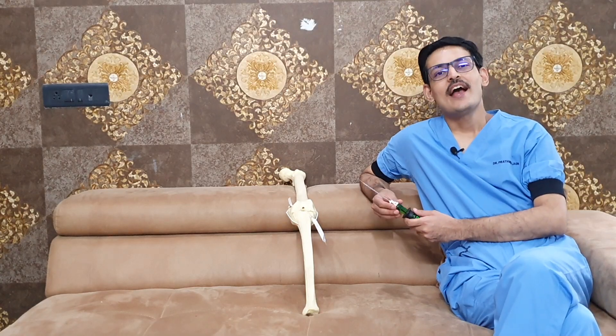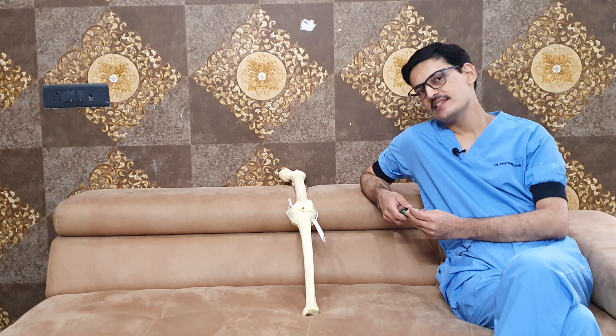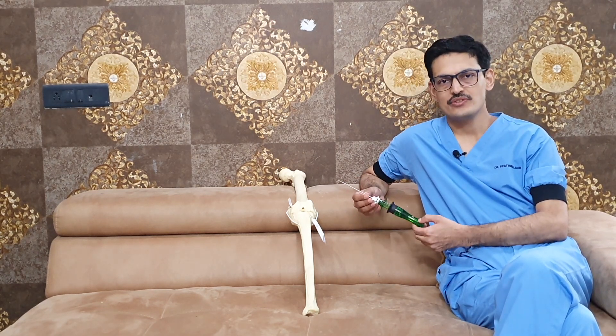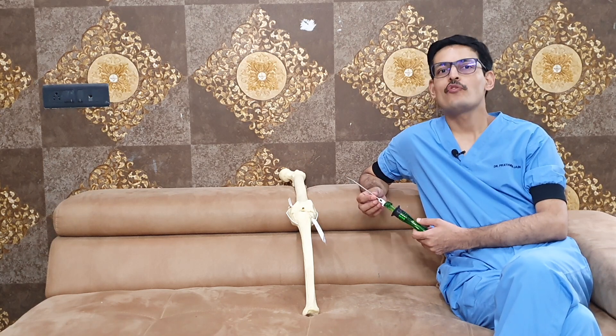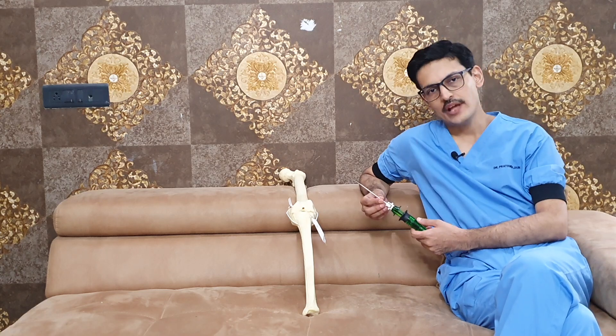Good morning friends. Today I'll be discussing the recent most advanced meniscus repair surgery device — this is the Jugger Stitch device. This device uses the benefits of both the all-inside technique as well as the inside-out technique.